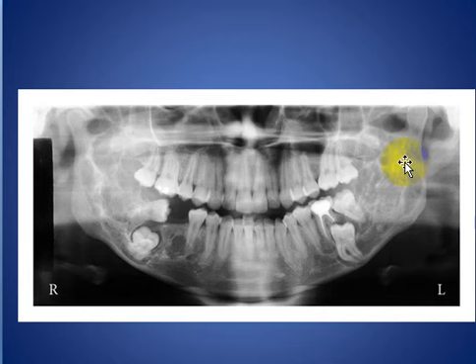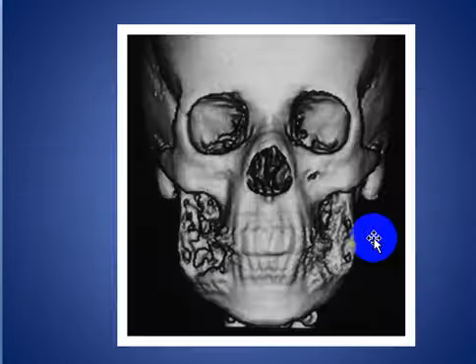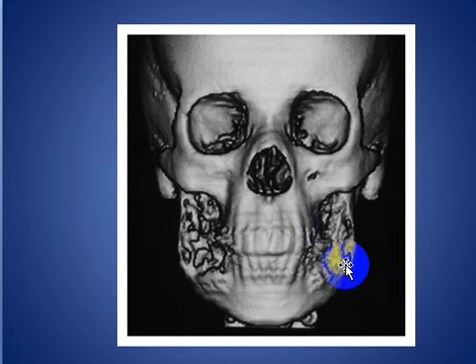Here another patient with cherubism, aggressive cherubism, as we see here, a bilateral lesion involving the mandible, body, and the ramus and coronoid process of the mandible bilaterally, and the 3D CT scan of this patient with multiple depression and bilateral vestibular cortical bone, retromolar region.